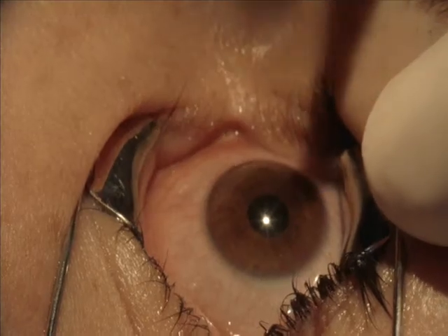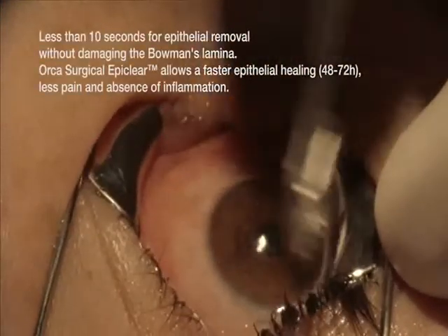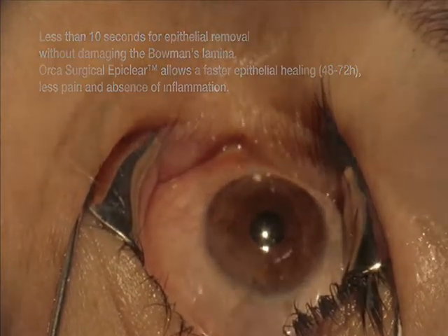Start the EBK with an angle of 40 to 45 degrees. We take about 8 to 9 seconds to achieve a very beautiful surface.